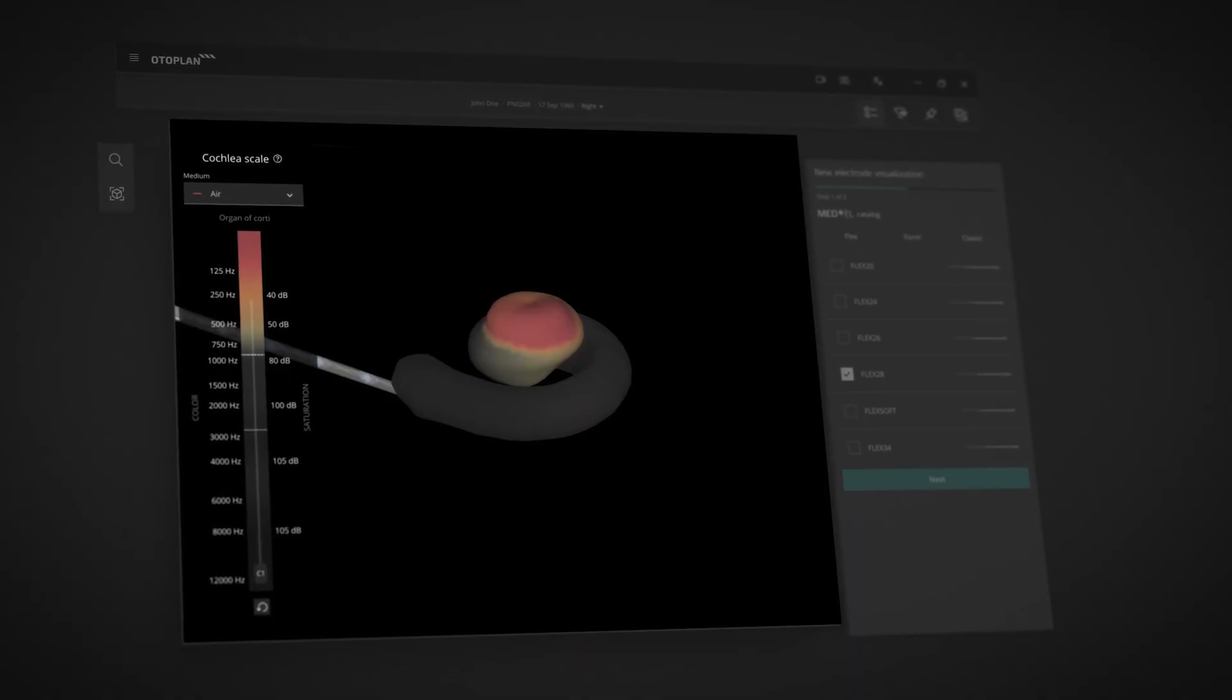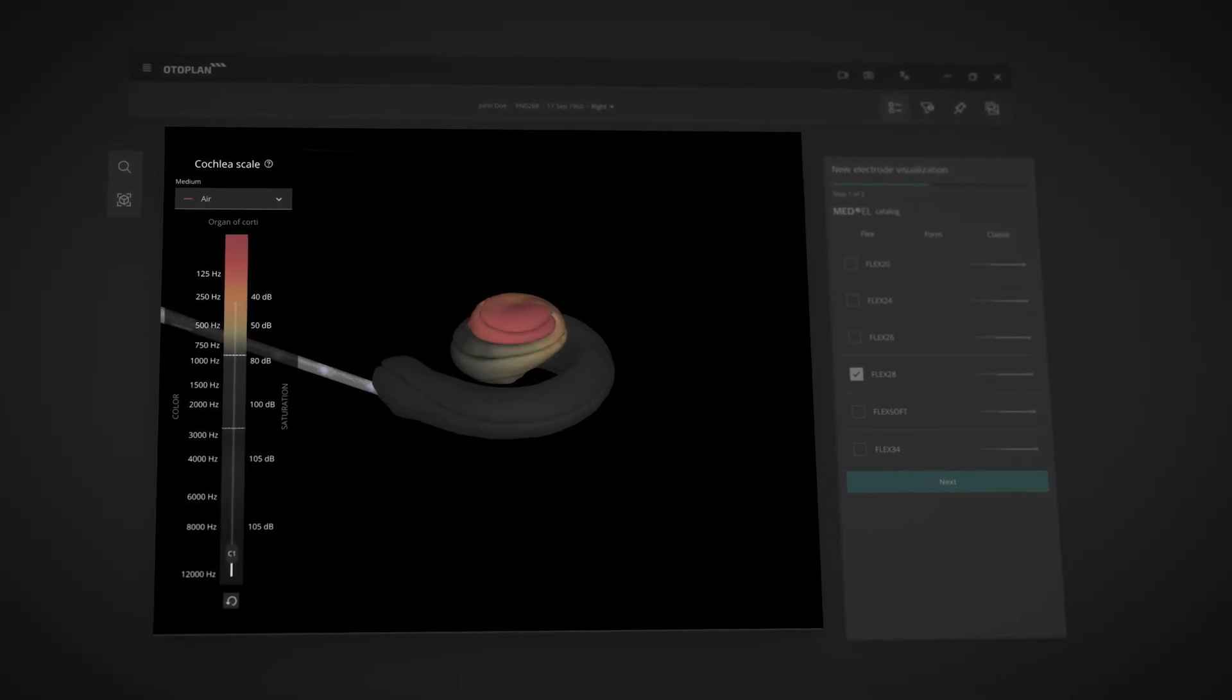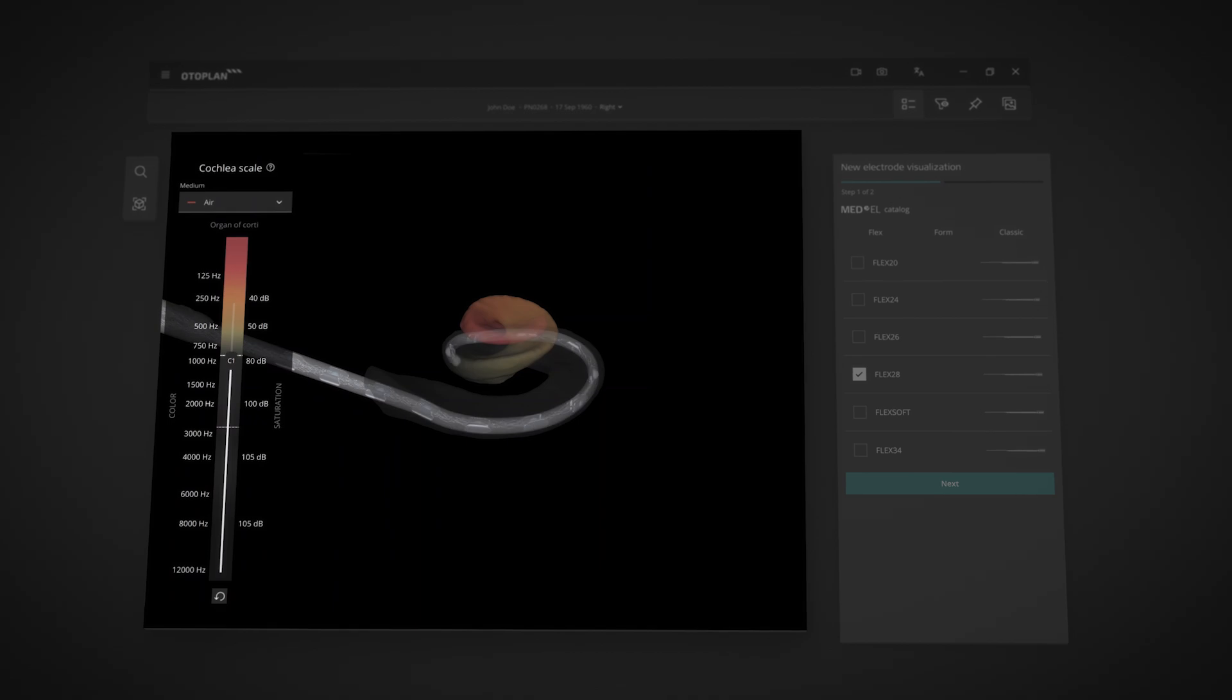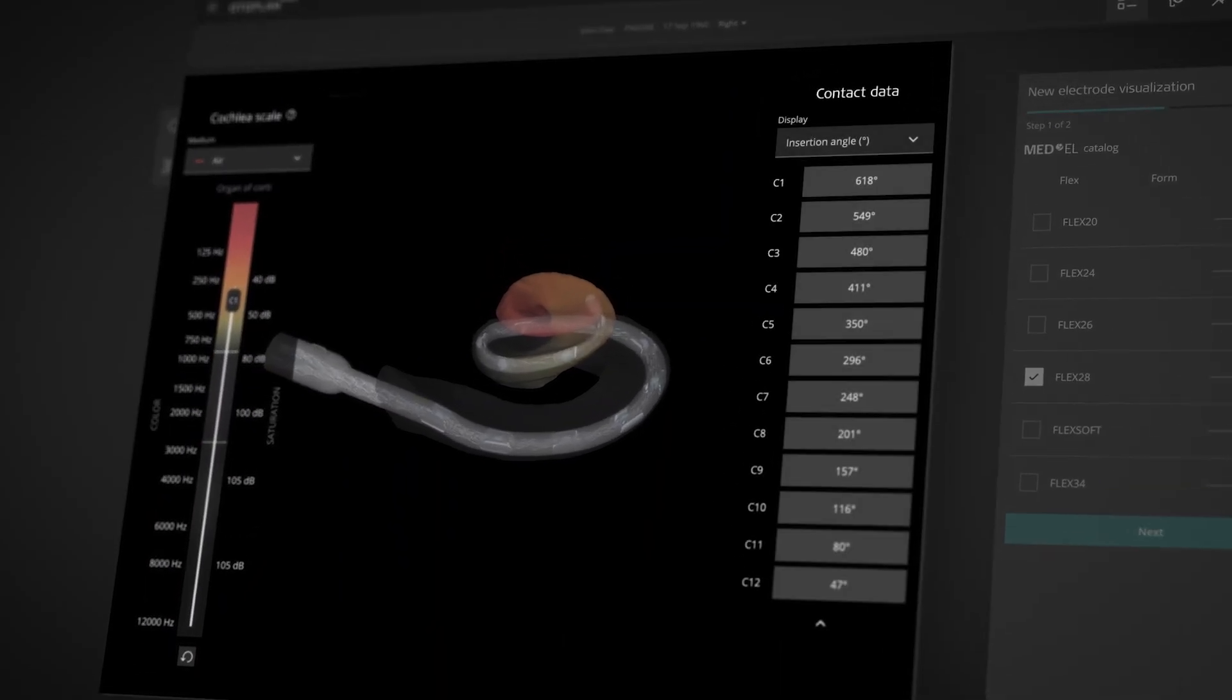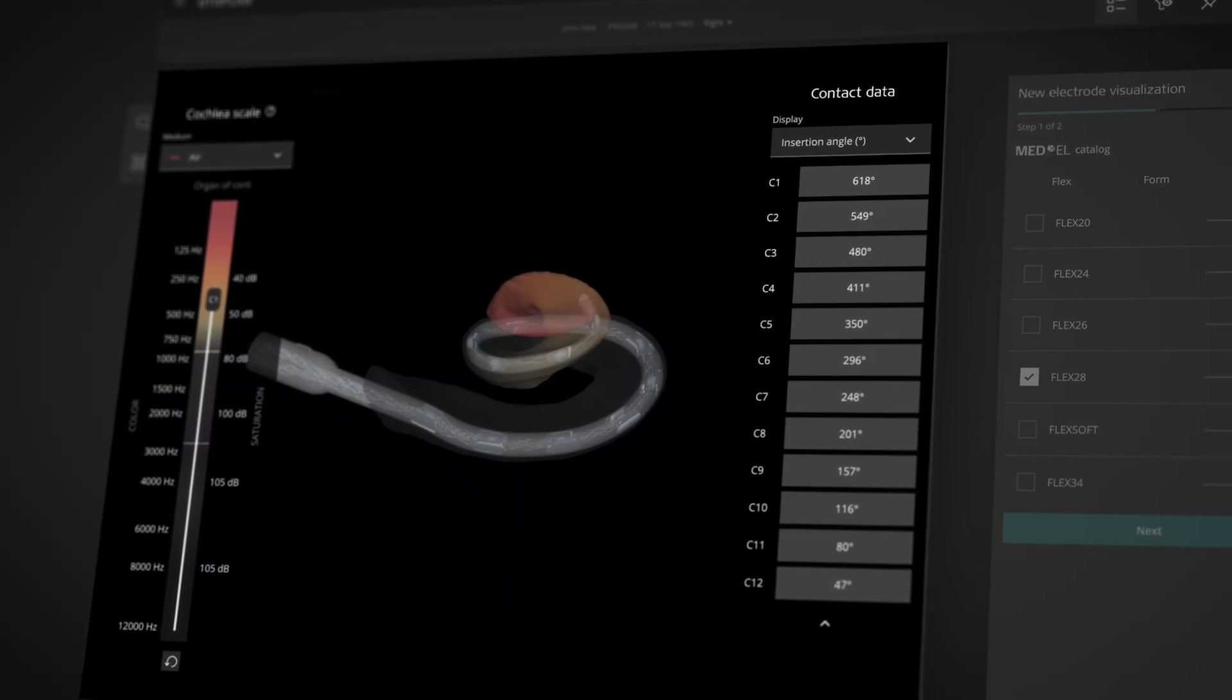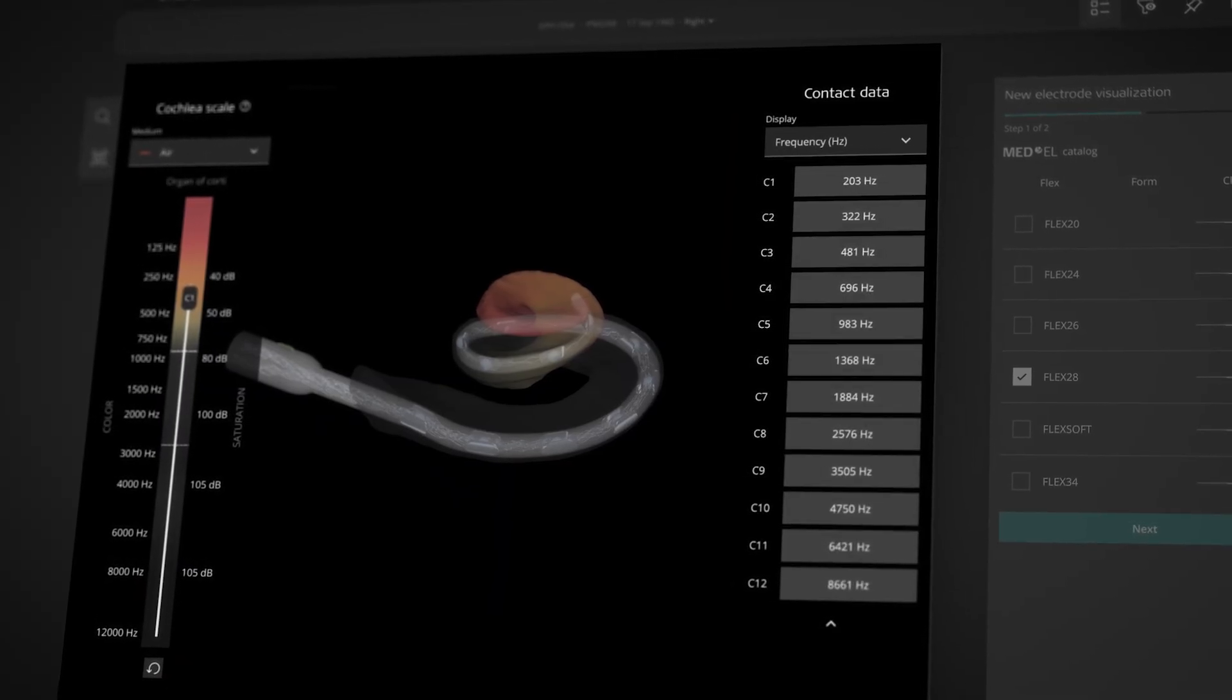OtoPlan can unlock the full potential of individualized implantation. With OtoPlan's virtual electrode insertion, you can compare different electrode arrays and even see detailed data for each individual electrode contact, including predicted insertion depth and the tonotopic frequency covered by each electrode contact.